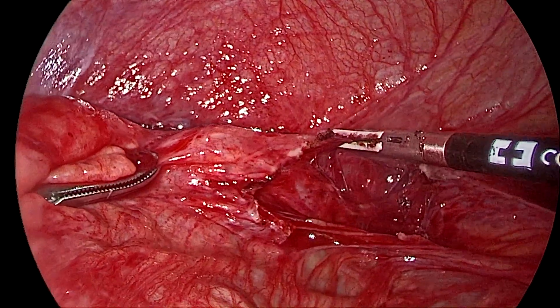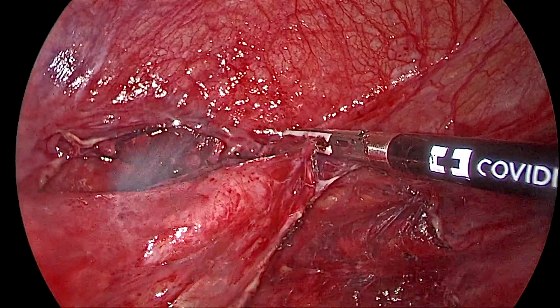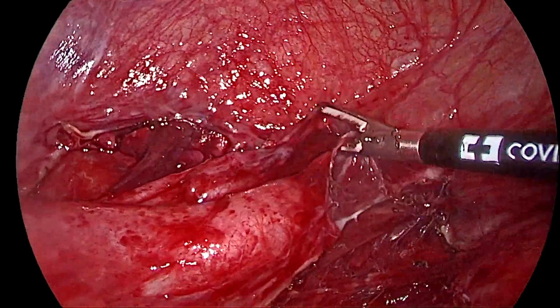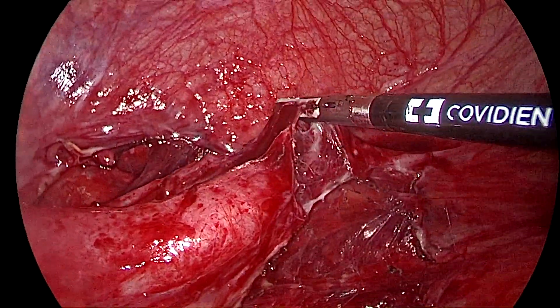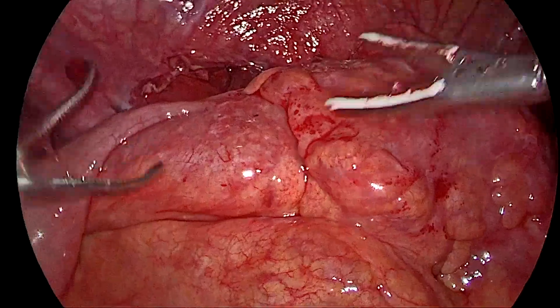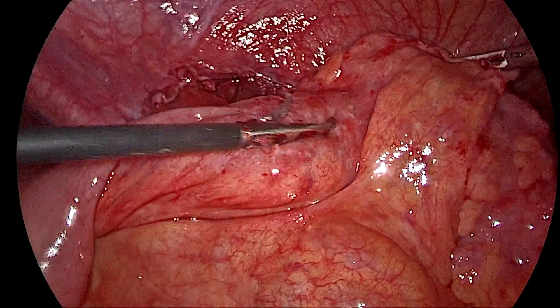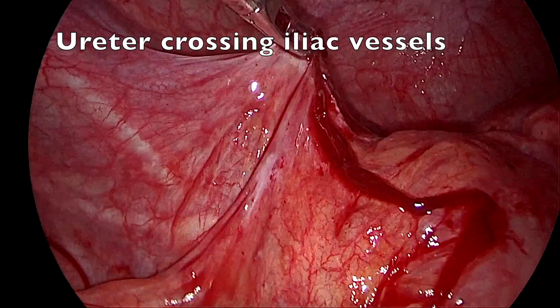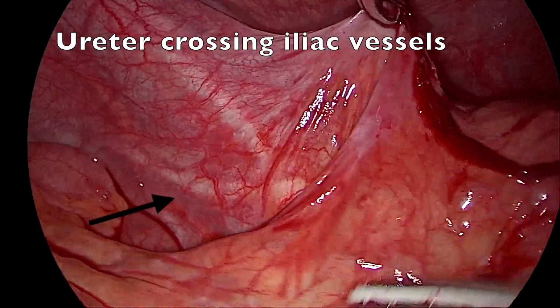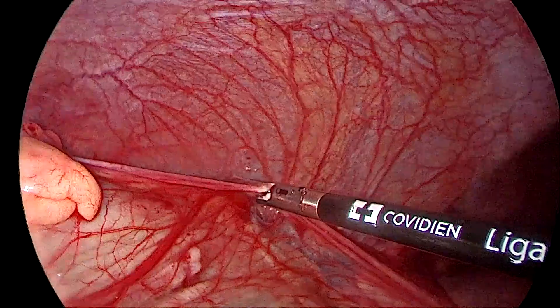You can see there is a lot of inflammation because of chronic tuberculosis. There are tubercles visible in the peritoneum and the planes are not very well preserved, so we have to be careful. You can see a big ileocecal mass, and you can see ureter peristalsis near the iliac vessels — we have to be careful about that.